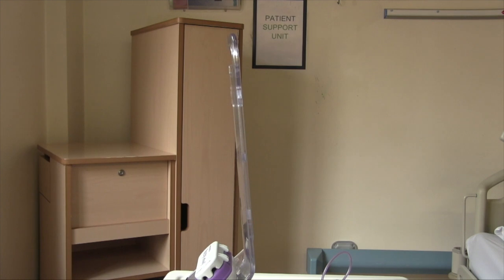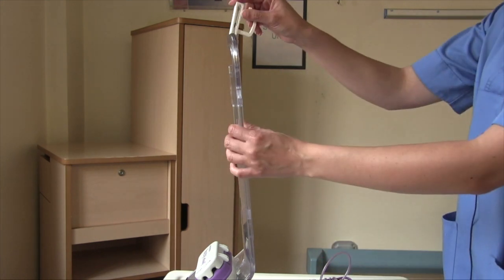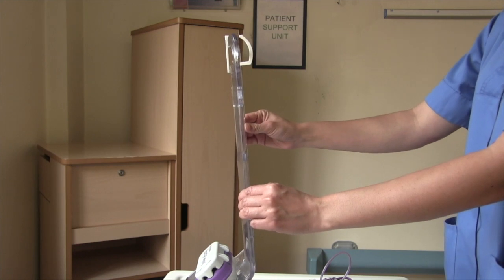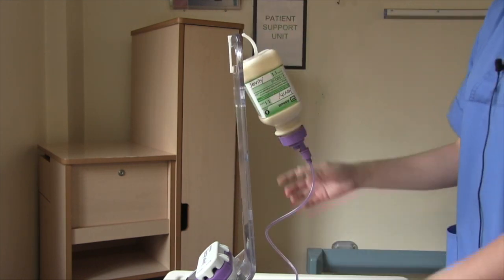When you screw the adapter onto the bottle, it will automatically break the seal. Now we will go over how to set up the feed on the stand. Take your Z connector and slip it over the top of the stand with the loop facing the back of the stand. Take your feed, and on the top there will be a loop where you can hook it on to the Z connector. Ensure the feed is on the back of the stand and not on the same side as your pump, as it will tip over.